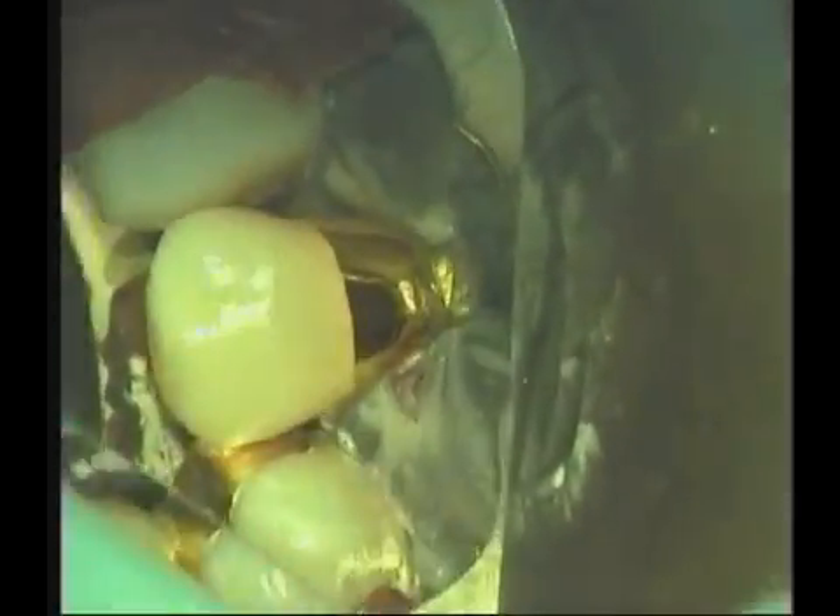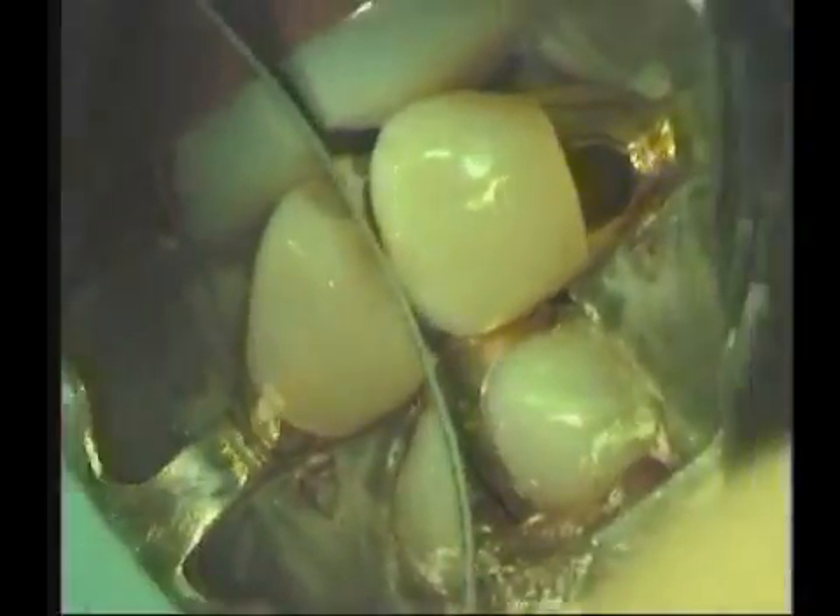And the foil is finished. When we finish the foil, I can truthfully say I've never seen a perfect one. You just do as well as you can under the circumstances.